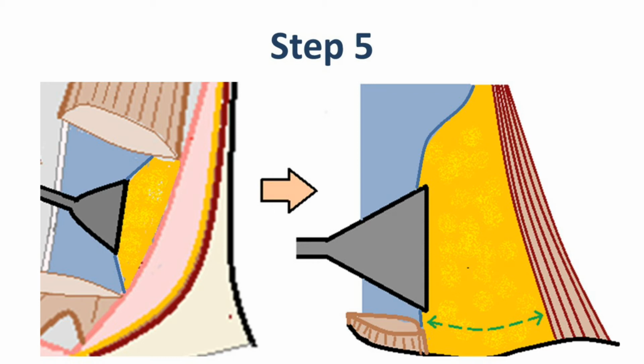On the left side, be careful about the flimsy thoracic duct and avoid damaging it. Also try to preserve the supraclavicular nerves which traverse this fatty mass to enter the pectoral region by running superficial to the clavicle.